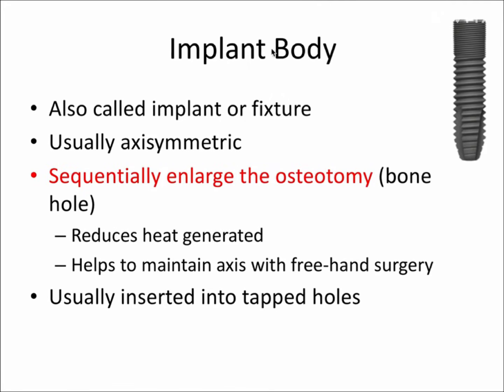So the implant body, also called just the implant or the implant fixture, is shown here in the top right. It's usually axis symmetric, which means if I were to draw a long axis down the center of this implant, it would be symmetric around that long axis.